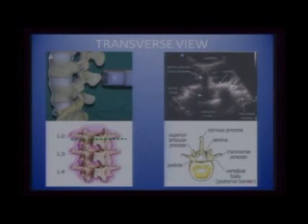But you will be able to pick up structures on either side, and on this side here, that is the laminae. And if you go farther away, you will see the transverse process here. And this hollow is where you will have the spinal canal, and that will be your vertebral body. You just have to correlate that with this picture below.